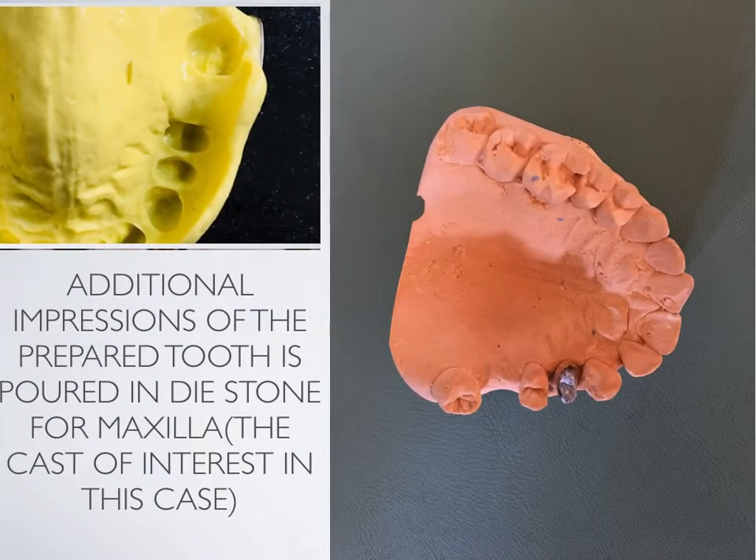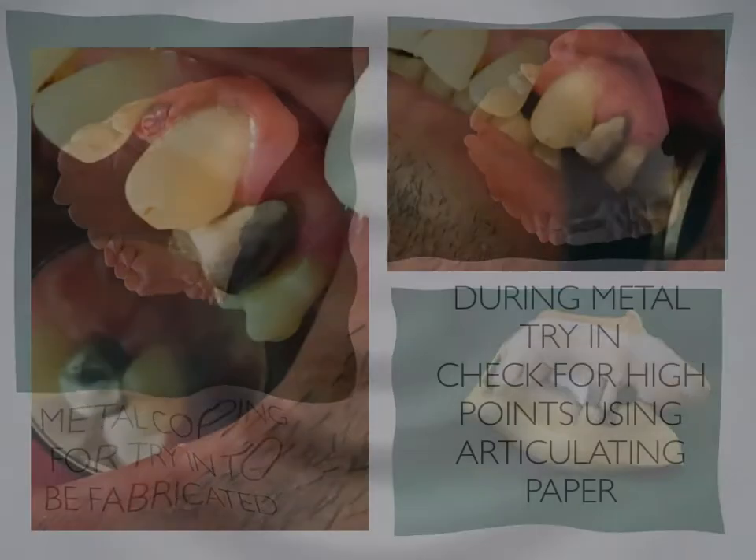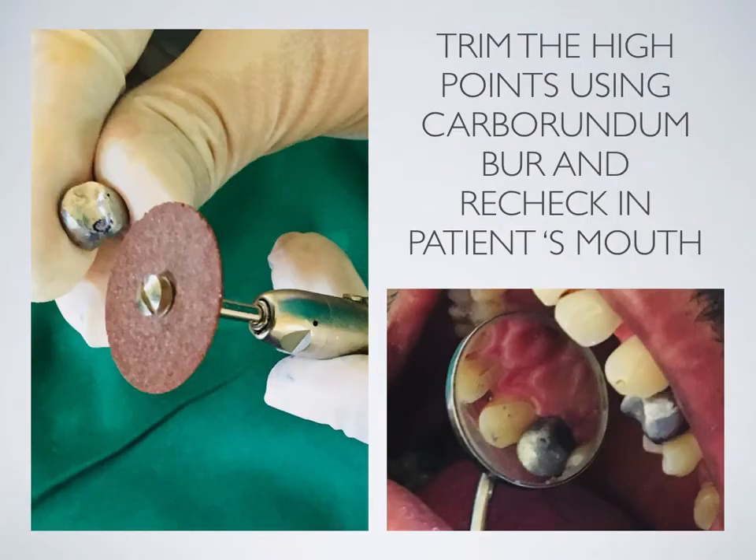Additional impressions of the prepared tooth are poured in die stone for the maxilla. The metal coping is made in the lab and is obtained at this point. During the metal try-in, check for high points using articulating paper. Trim the high points using a carborundum burr and recheck in the patient's mouth. In case of any gross changes, resend it to the lab.